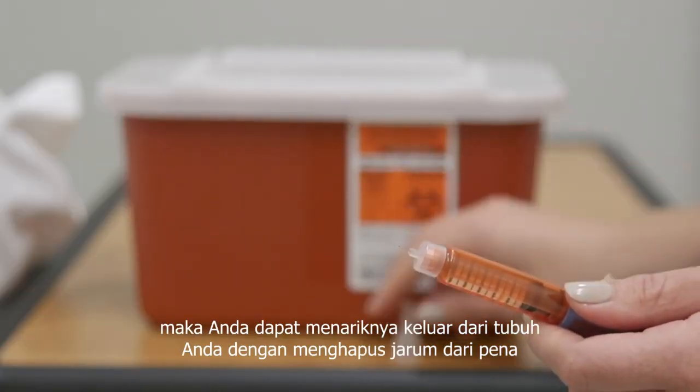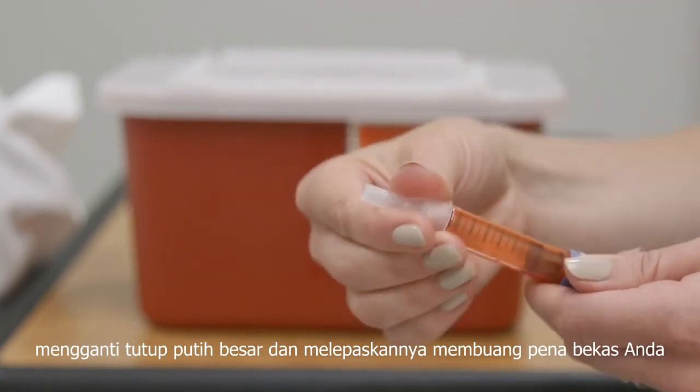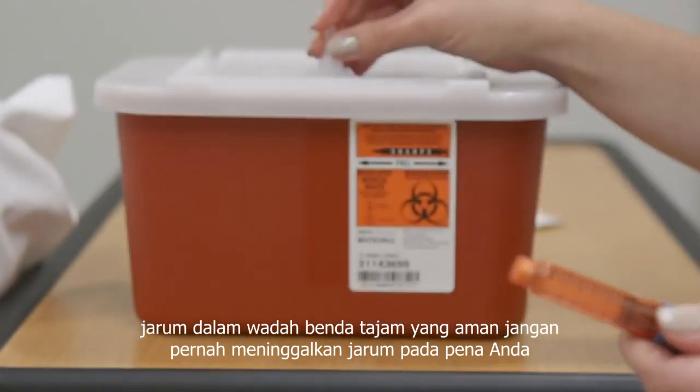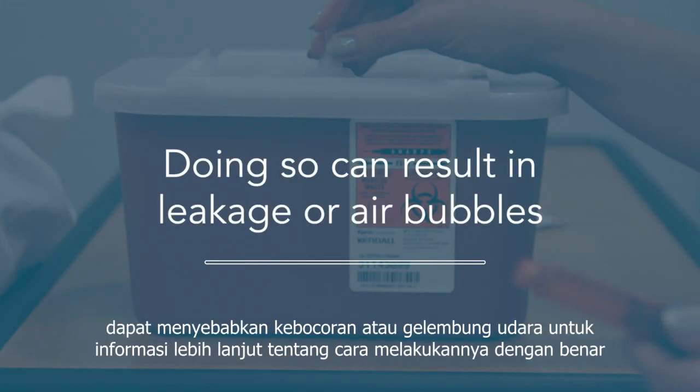Remove the needle from the pen by replacing the large white cover and unscrew it. Dispose of your used pen needle in a safe sharps container. Never leave the needle on your pen. Doing so can result in leakage or air bubbles.